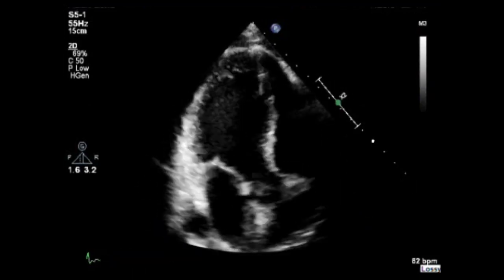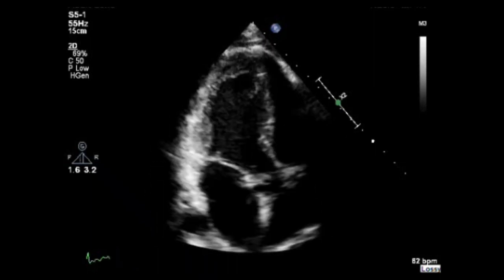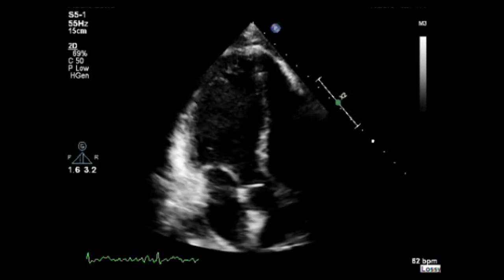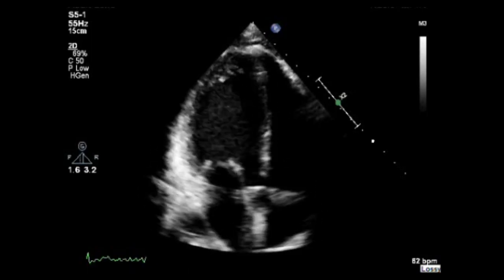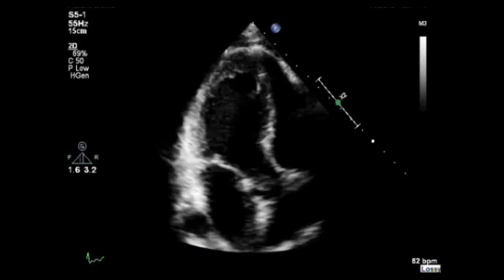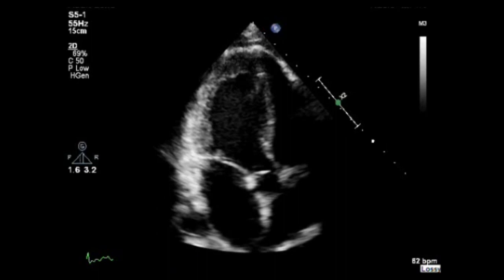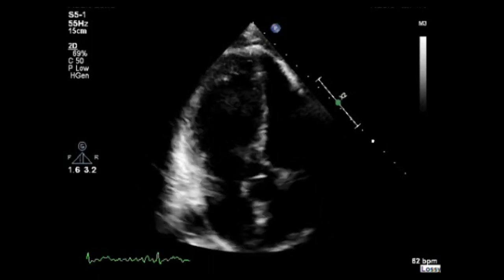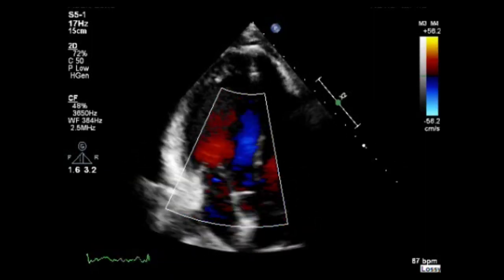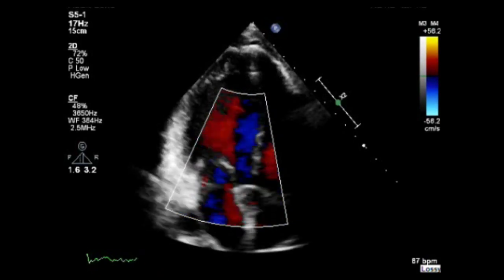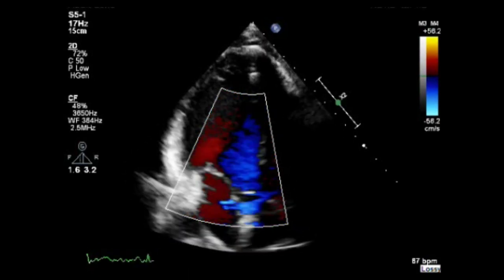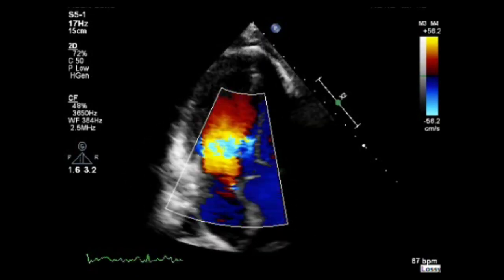Now obtain an apical 3 chamber view and perform a visual assessment of the cardiac chambers — the left ventricle and the left atrium. Also assess the mitral valve, the aortic valve, and the left ventricular outflow tract. Analyze the inferolateral wall motion and the anteroseptal wall motion. To finalize, use color Doppler to assess the blood flow across the mitral valve, the aortic valve, and the left ventricular outflow tract.